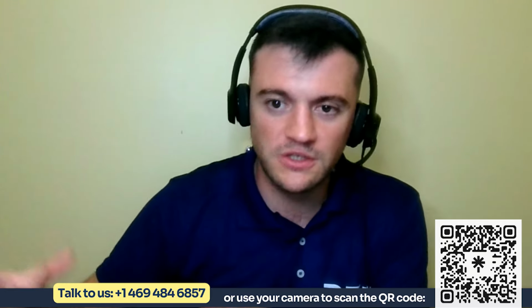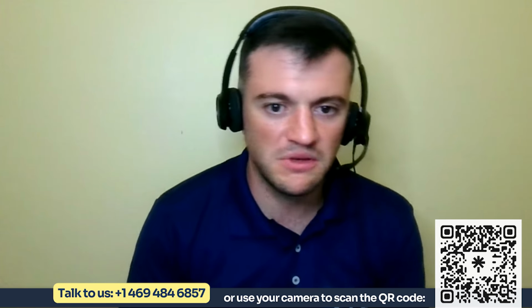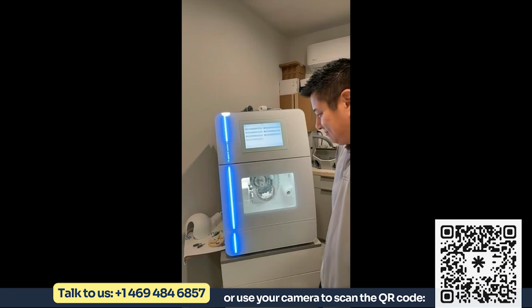Basically you have something like a radiator, called a spindle chiller, that stays on the side of the mill and pumps cool water. The water runs through the spindle, comes out warm, and keeps on this cycle. That's the main difference. Is one better than the other? I'm not sure. It depends a lot on the kind of operation that you have. I told you he was smart.